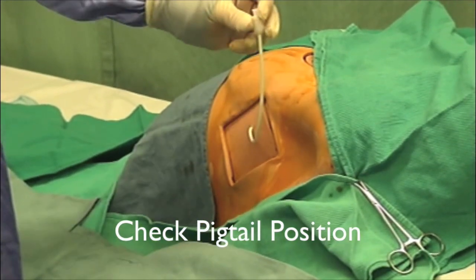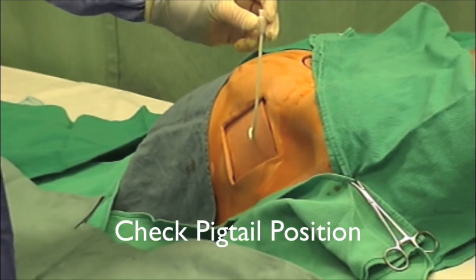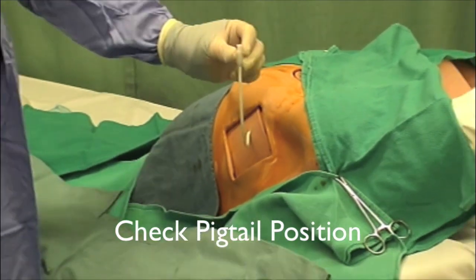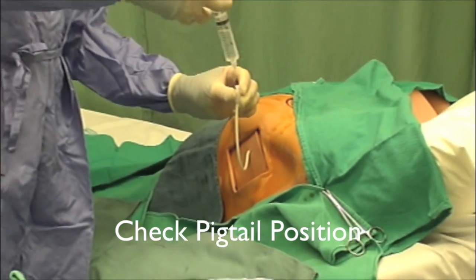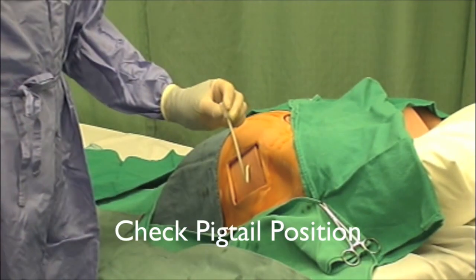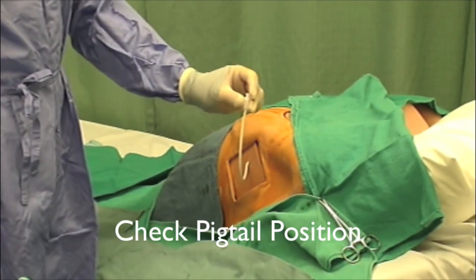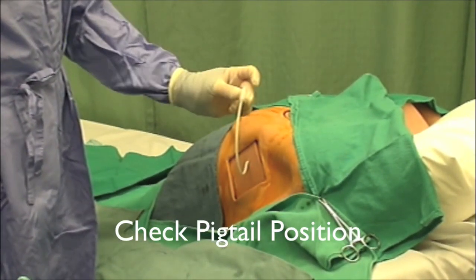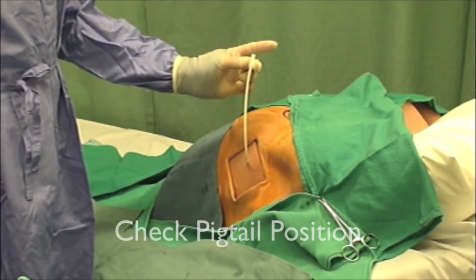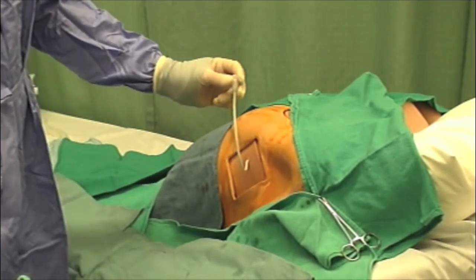Place a few drops of normal saline or lidocaine in the catheter opening. If the catheter is in the pleural space, the fluid will flow down the catheter. Ask the patient to cough and the fluid will be expelled.